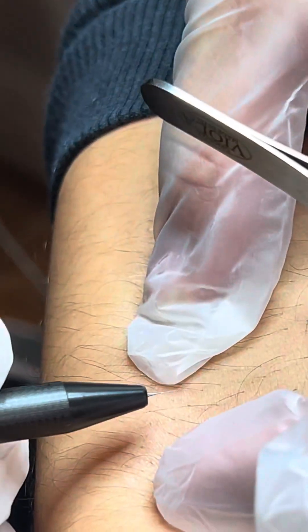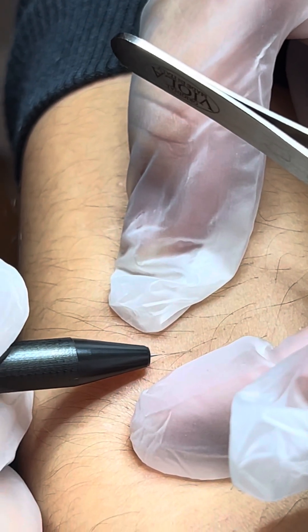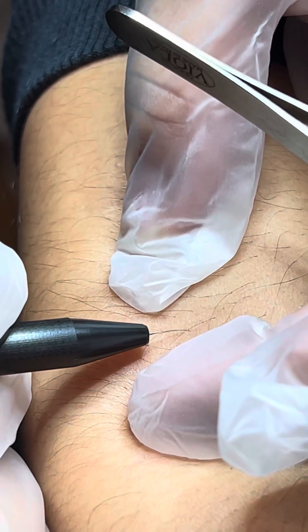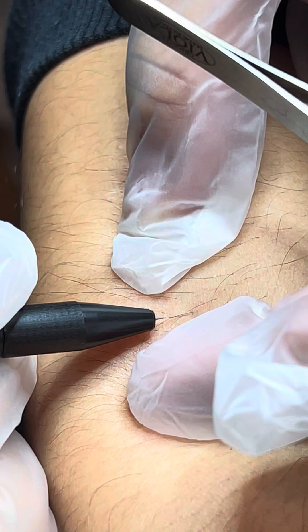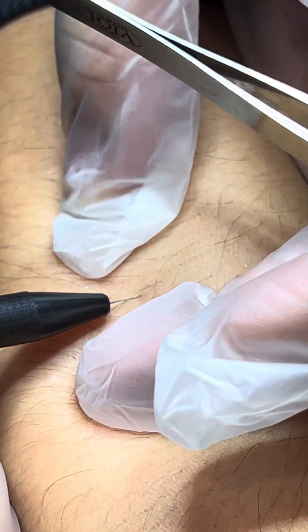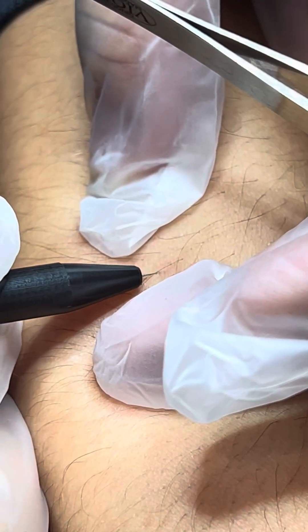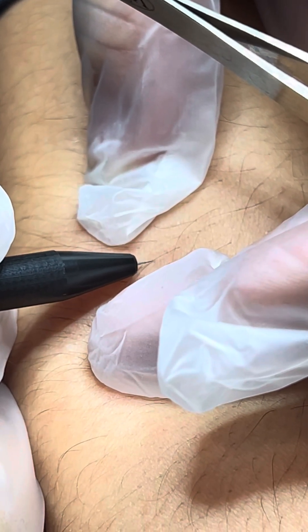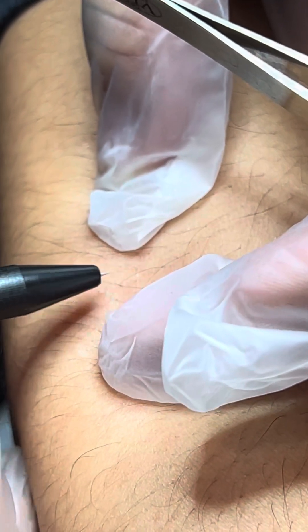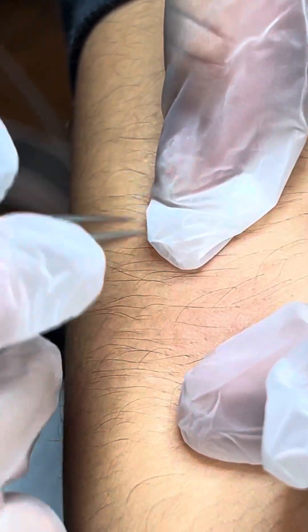Spread — yes, and then follow that little follicle, that little... am I good? I don't think I was in enough. Okay, we'll find out, right?